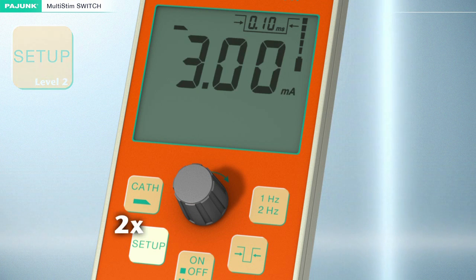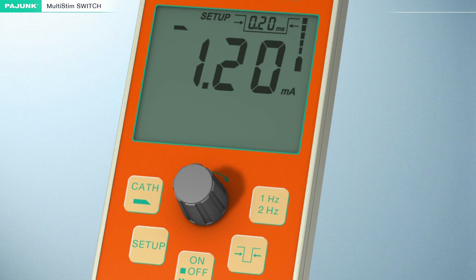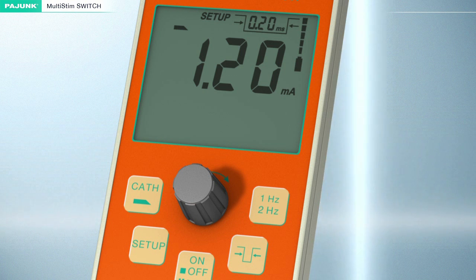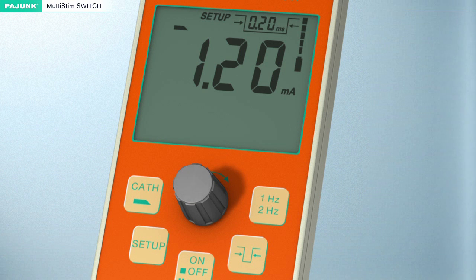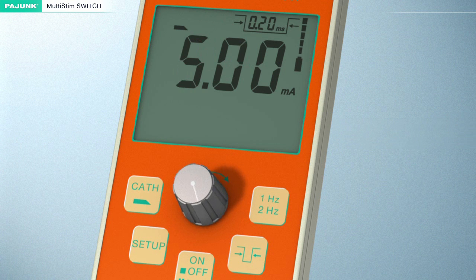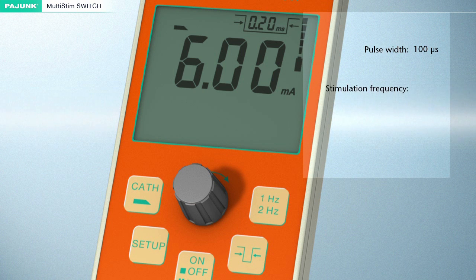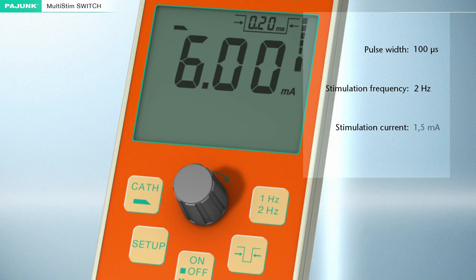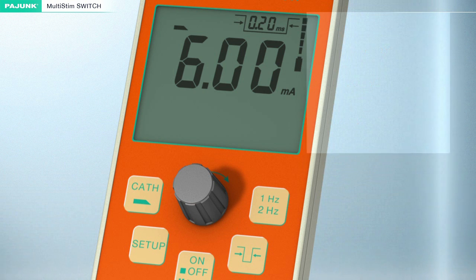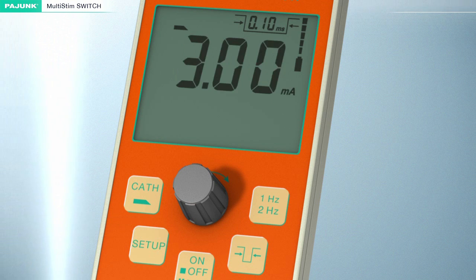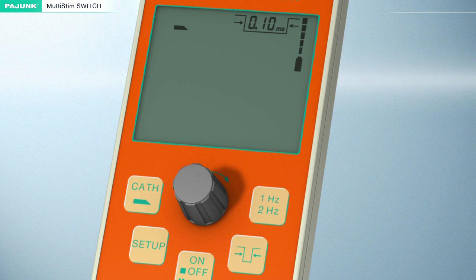Setup level 2. The cannula mode can be adjusted in level 2. Individual stimulation parameters differing from the manufacturer's default settings can be defined. The settings for the frequency and the impulse bandwidth must be adjusted in normal operation, before pressing the setup button for the first time. The intensity of the current can still be varied in the setup function by turning this knob. The factory settings for the cannula mode are: pulse width 100 microseconds, stimulation frequency 2 hertz, stimulation current 1.5 milliampere. The setup button must be pressed for at least 2 seconds to permanently store the values. A monitoring sound will be emitted upon successful storage, then the device will switch to pause mode automatically.